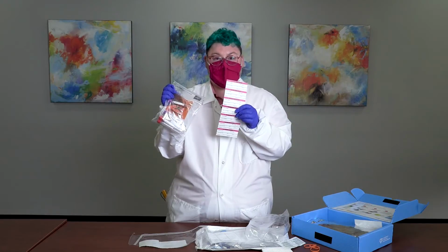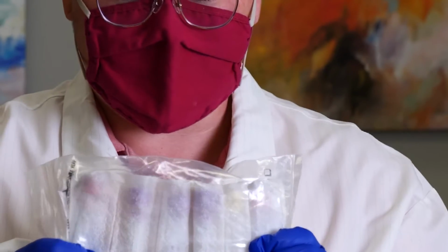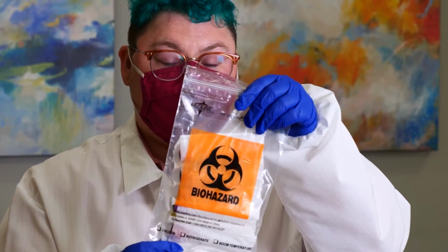Each maternal sample needs 2 maternal identifiers, such as name, date of birth, and MRN. Once the maternal samples have been collected and labeled, they'll be placed into the tube separator pouch and then put into the biohazard bag for return to the cord blood lab.